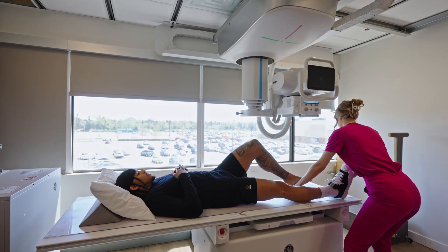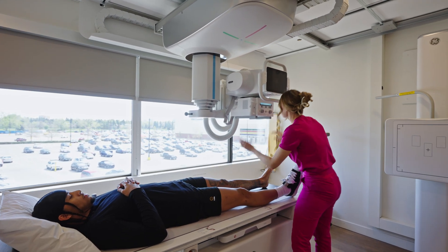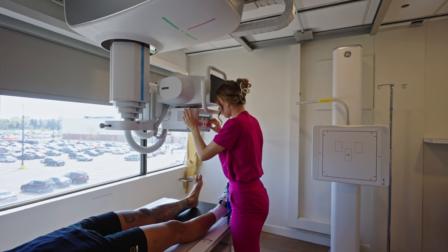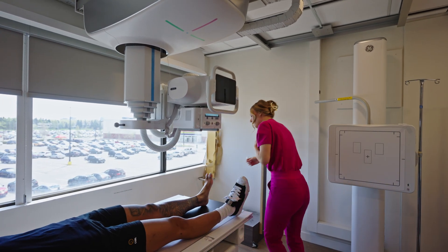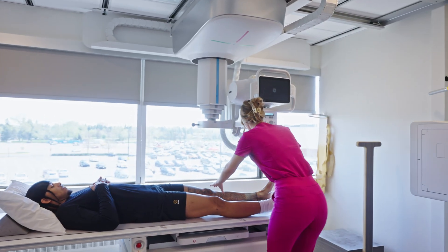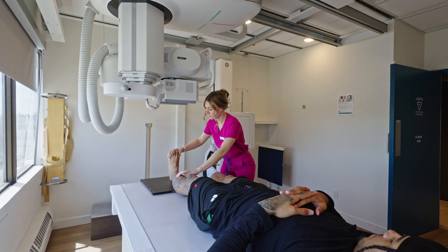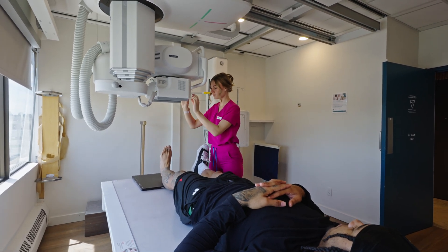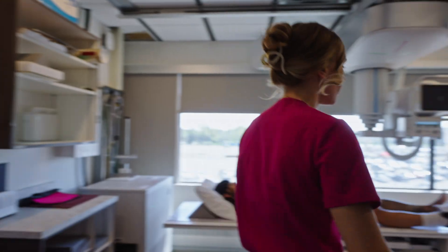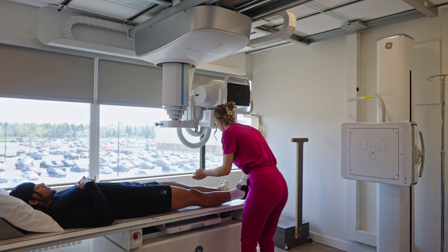Just lift your leg up for me, good, and you can straighten it out again. Good, and then just have your toes right up and turn your leg in a little bit. Just stay like that while we take the first photo. Next photo, I just want you to turn your leg in a little bit more towards me. Next photo, you're going to turn your leg all the way out — there, good — and then just keep your toes up still.